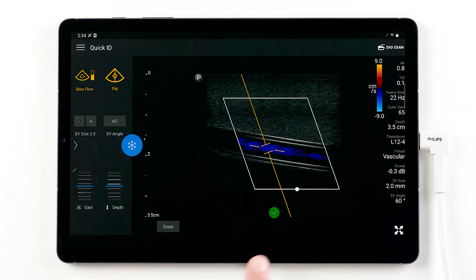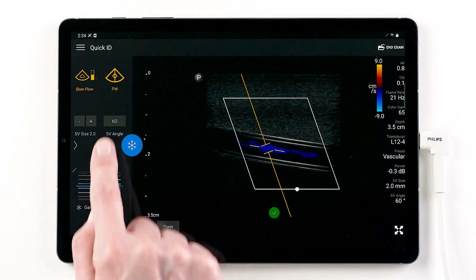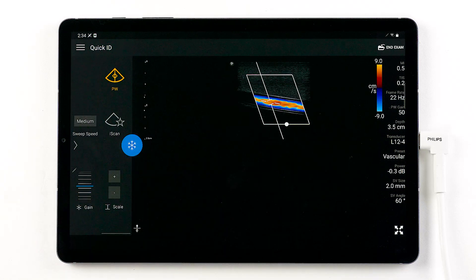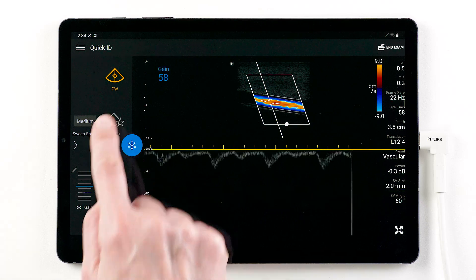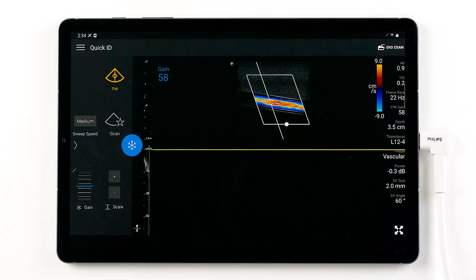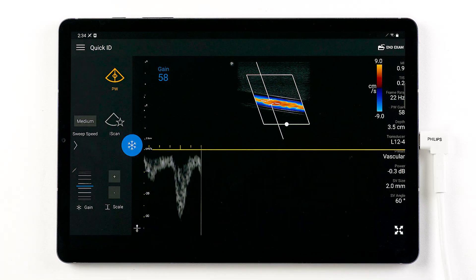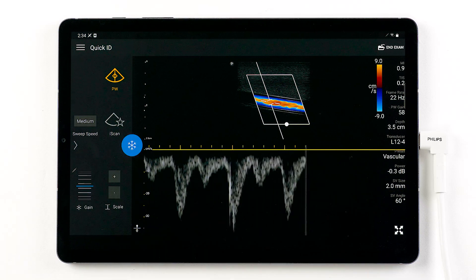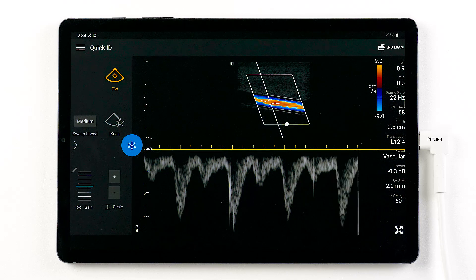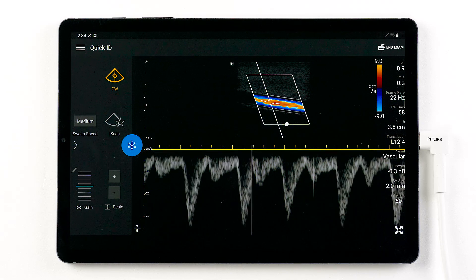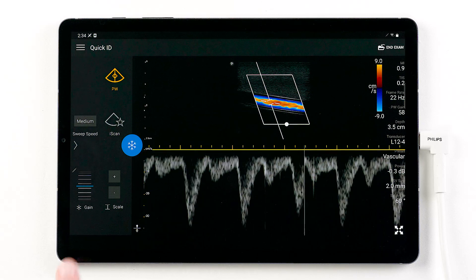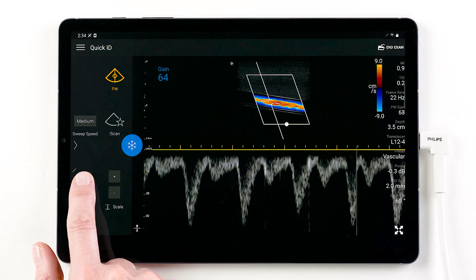Tap the green dot or tap on the pulse wave icon to enable pulse wave Doppler. Tap iScan to auto-optimize the scale, baseline, and gain settings to simplify your Doppler workflow. You can manually make the desired changes including change gain.